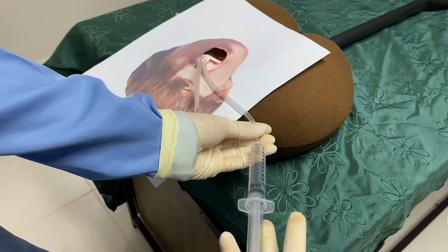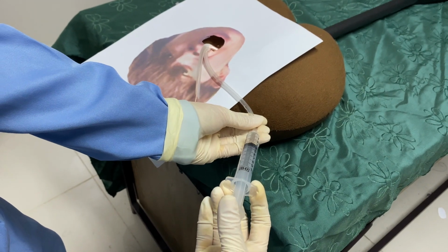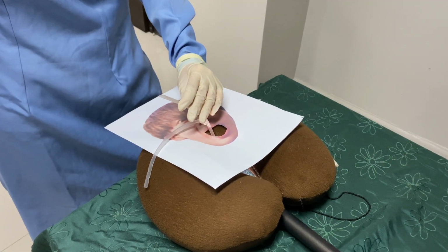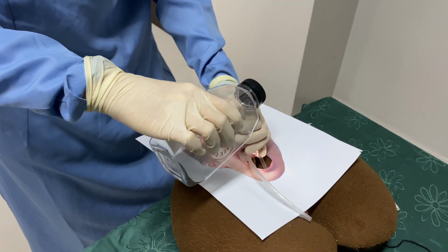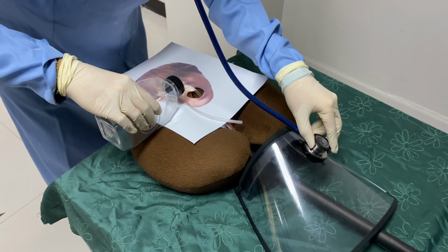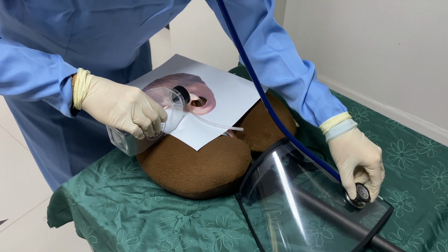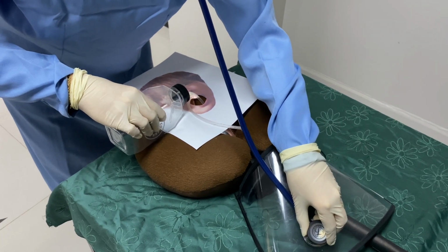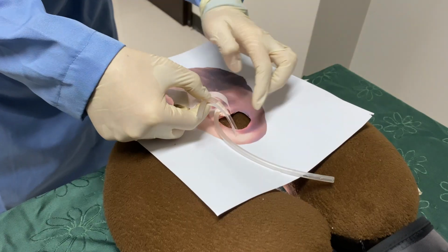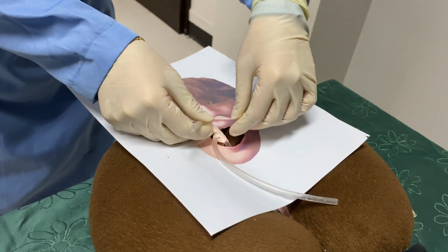In order to secure the tube within the trachea, inflate the cuff using 10 cc of air from the syringe. Once done, remove the stylet and attach the tube to the bag. Confirm the proper placement of the tube by auscultation. There must be equal breath sounds in both lung fields and absent gurgling sounds in the epigastrium. Also observe for equal chest rise. Lastly, anchor the endotracheal tube at the right side of the mouth using the plaster.